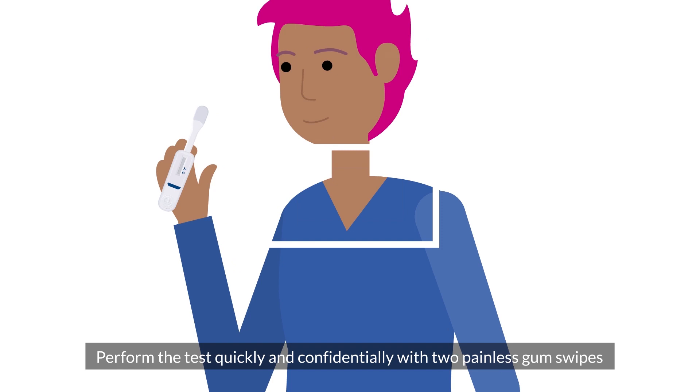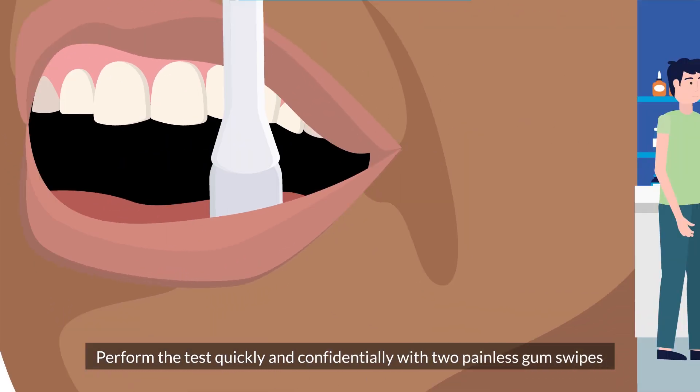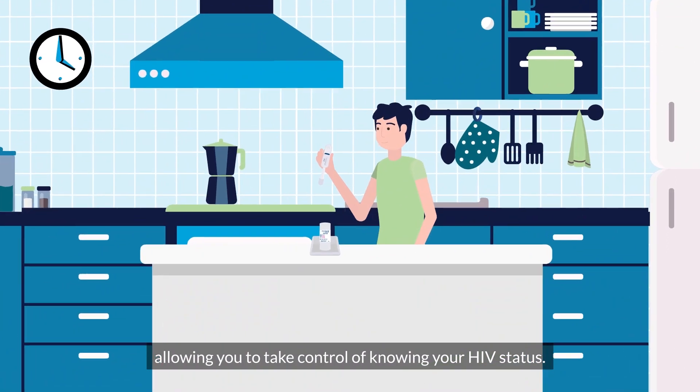Perform the test quickly and confidentially with two painless gum swipes. It can be done anywhere, anytime — allowing you to take control of knowing your HIV status.